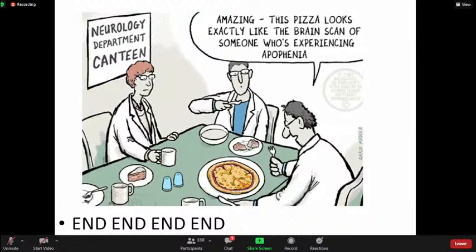There's only one question. The difference between T1 and T2 on MRI. The difference is in terms of the physics, but when you're looking at images, basically, on T1, CSF is going to be dark. I think that is what you need to remember. Fat shows different. It's bright in both. Air is dark in both. So those are some of the things, but the physics may be a little difficult because of the physics behind it.